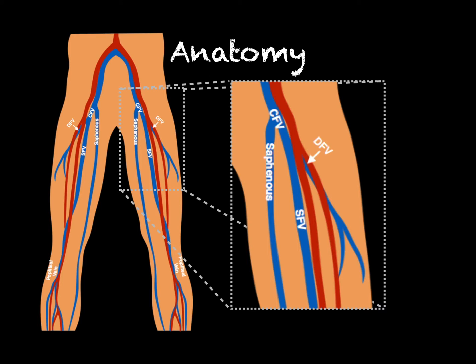We're going to look at the anatomy, zooming in on the area of the saphenous vein to see that junction. The saphenous vein helps you locate yourself along the venous system and orient yourself to what you should be seeing — so that's what I always look for first. Keep in mind that it takes off medially on the patient, and when orienting ourselves, we want to see it coming off medially. This will change on your screen orientation depending on whether it's the right or left leg.